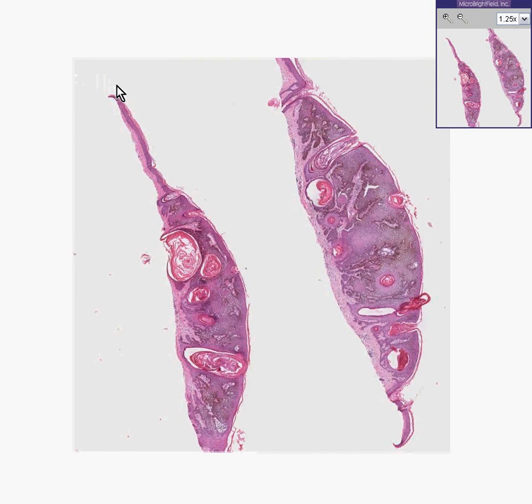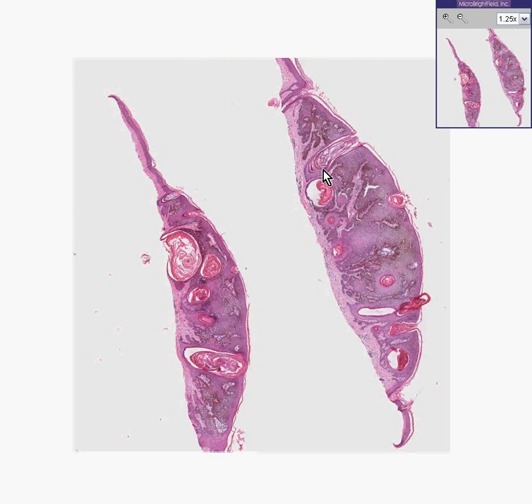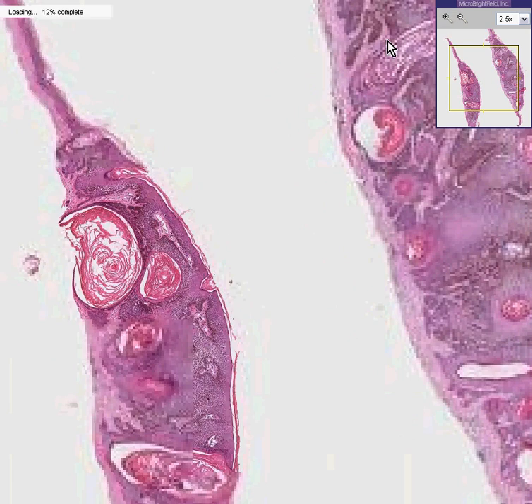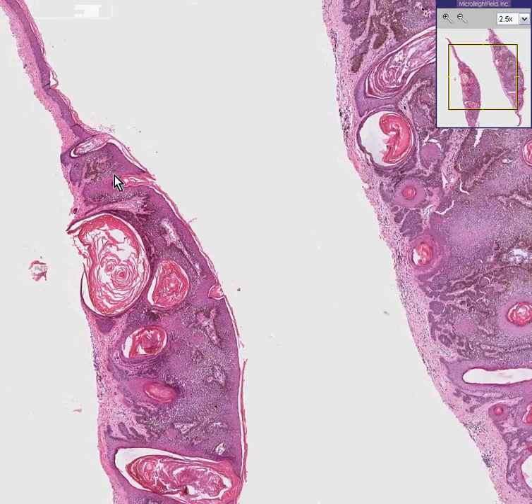Here is another section of a thickened keratotic lesion on the skin. At this power, you can see these little horn cysts with whirled keratinaceous material in the center. You can recognize instantly this is seborrheic keratosis, just like the last case.